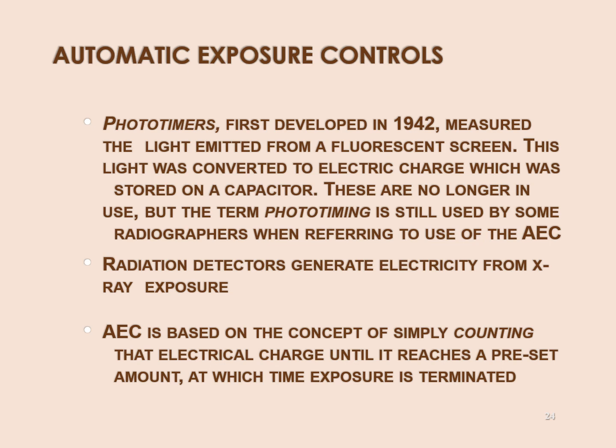So you would put a fluorescent screen in the bucky behind the film screen cassette, okay? And so X-rays that penetrated all the way through the film and out the other side, through the film cassette, would hit the fluorescent screen and cause the fluorescent screen to glow. This gives off a light photon. The light photon enters a photomultiplier tube where it's turned into several light photons, and then at the very top of the photomultiplier tube, all the light photons are turned into electrons that flow down a wire toward a capacitor.